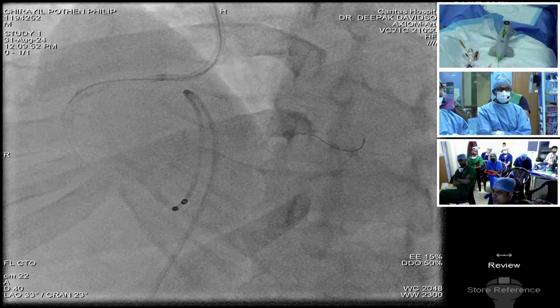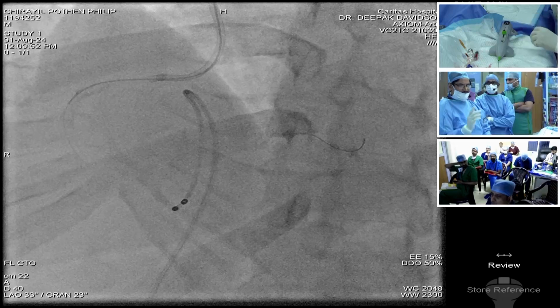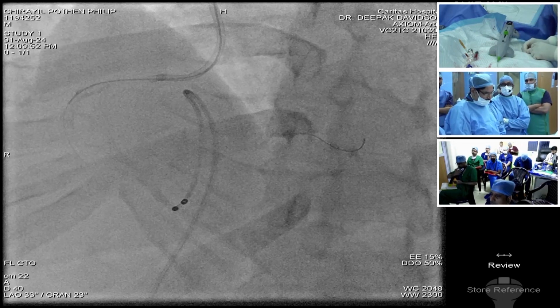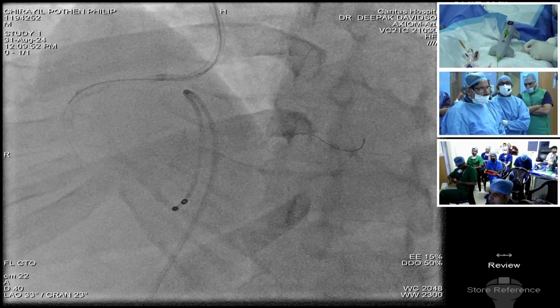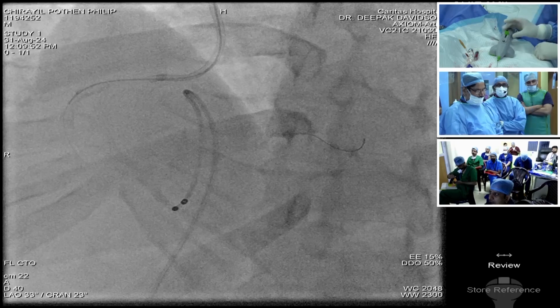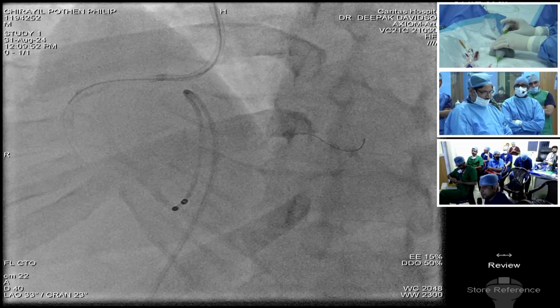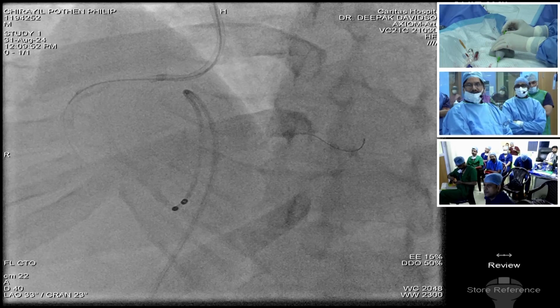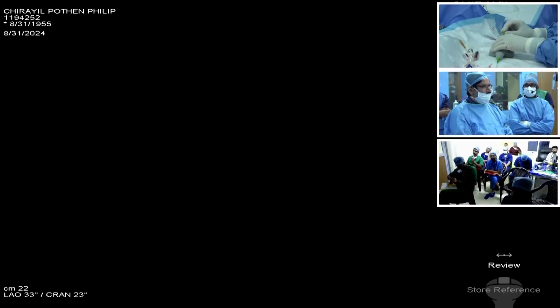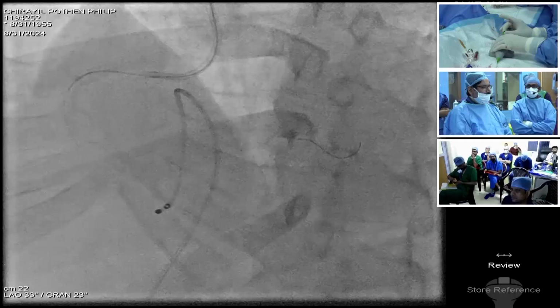Timer on. One question: once that sound comes, you have to stop. In rotational, there is a role of wire bias, but in orbital, they're telling that wire bias is not so important. No wire bias. In large vessels, the crown is unlikely to touch the opposite wall. Very true. Except in areas where we saw small nodules hugging the imaging catheter, there rota would also help. But most of the time in these huge vessels, when you have a reasonably good lumen, it wouldn't touch the vessel.